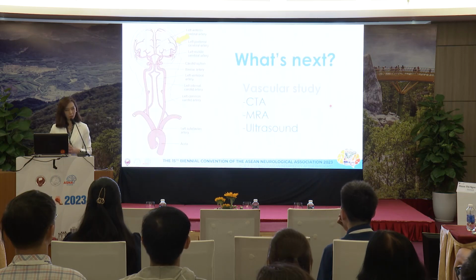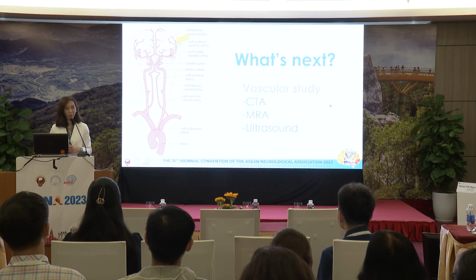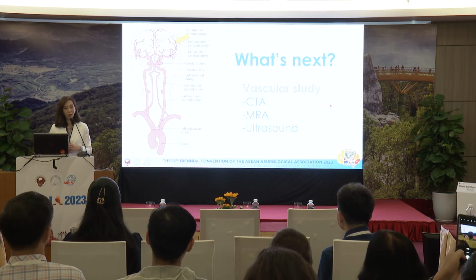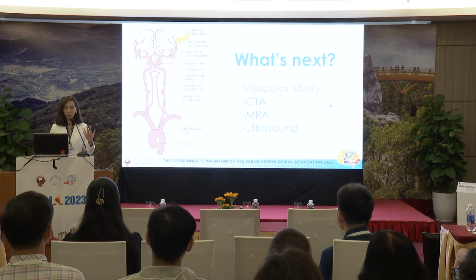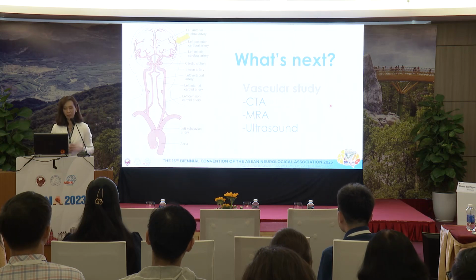So the next thing we should consider is to look at the blood vessels that supply the brain on that side. It's likely to be in the territory of the middle cerebral artery because she's having weakness in the arm. Sometimes she had aphasia, meaning there is cortical involvement, so it's likely to be the MCA territory. When you want to look at the blood vessels that supply the MCA, you look at the carotid on that side, and also the MCA on that side.